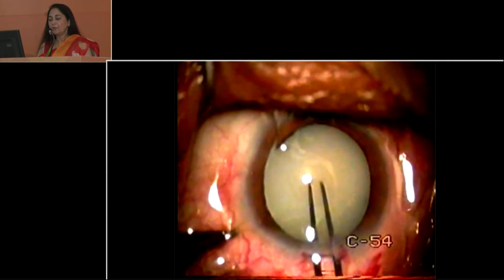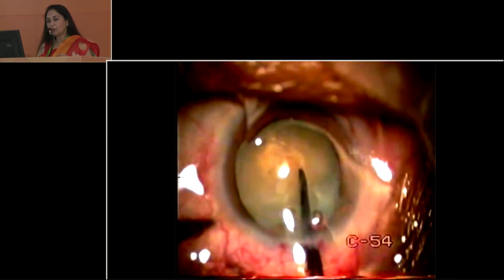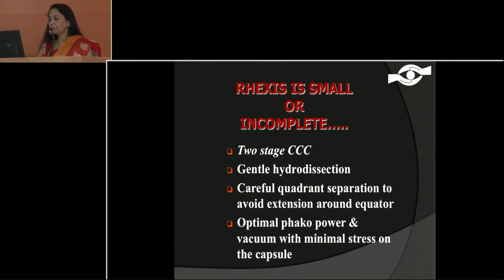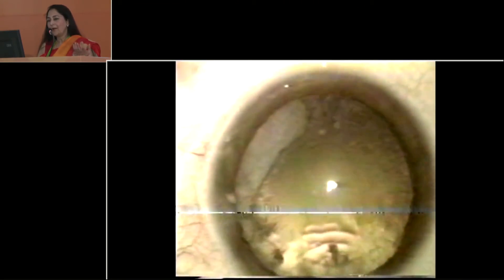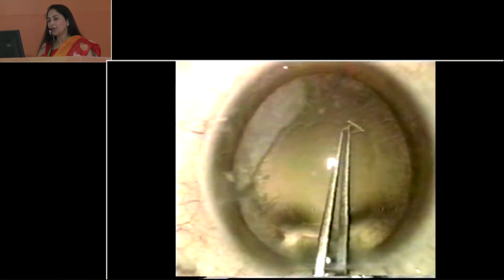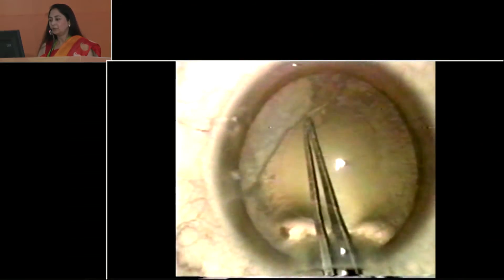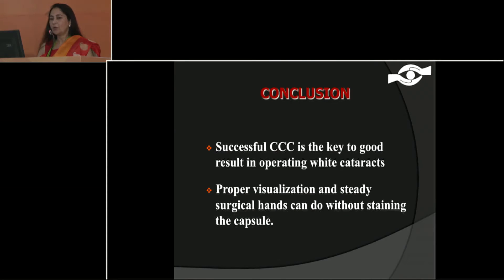Here is another case with milky cortex coming out. Pinch, make a rhexis, make a flap right at the center, come out. You can put some more viscoelastic to wash away the fluid cortical matter, and then the same way complete your rhexis. This is a two-stage CCC. At any stage where you feel there is a lot of adherent cortical fibers on the anterior capsule, you can enlarge the rhexis before putting the implant — you will have much greater ease during irrigation and aspiration. You need a good viscoelastic and good focusing of the capsule.